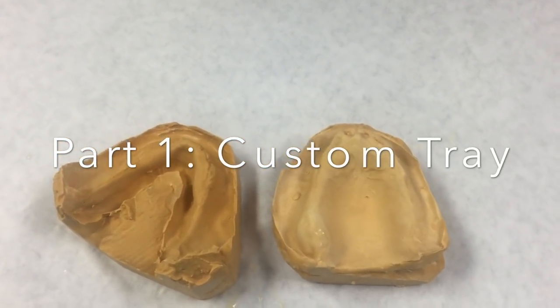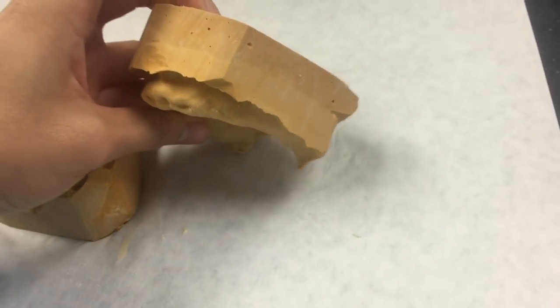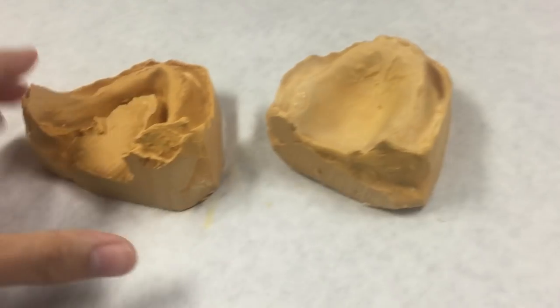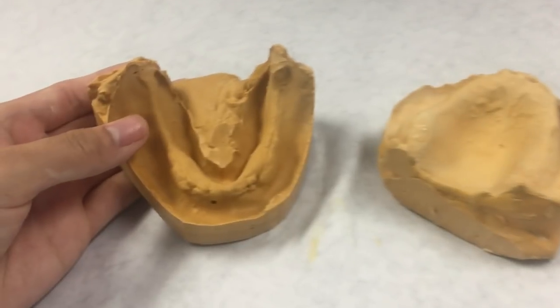The first thing you want to do is take alginate impressions of the patient's mouth. Alginate is not a good material for a final impression because it can distort, so we are only taking the alginate impression just to get a good idea of what the mouth looks like in general.